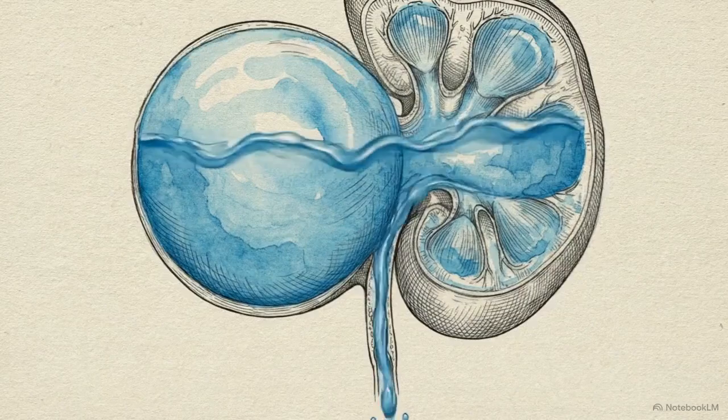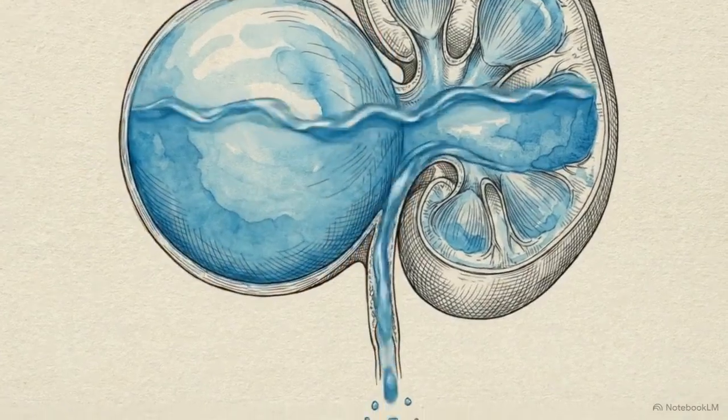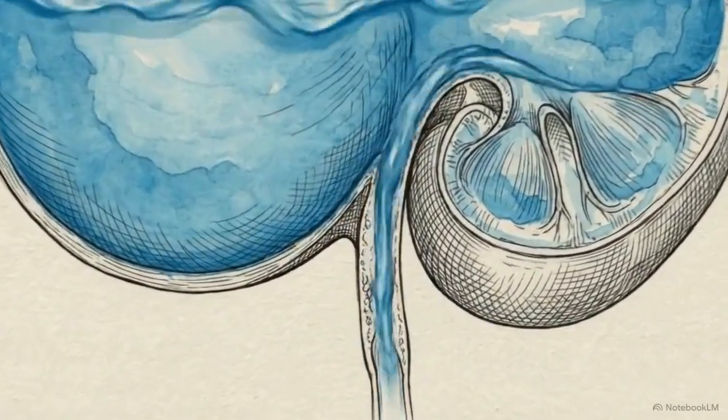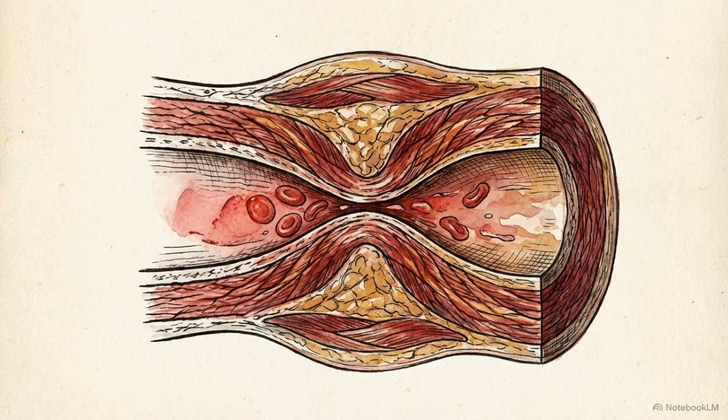This usually happens when the reservoir effect is so extreme that even the diuretic cannot rapidly flush the massive volume of pooled fluid. Without the pharmacologic stress of a diuretic, anatomical compliance completely obscures the diagnostic truth of the baseline time activity curve. We apply a similar stress test logic to vascular issues, specifically renal artery stenosis.